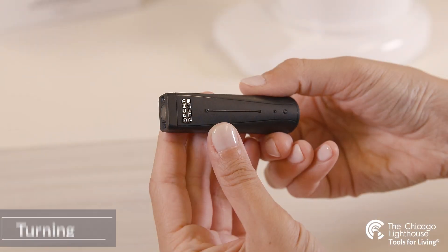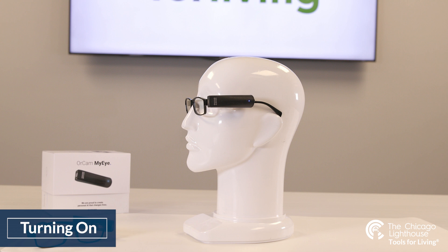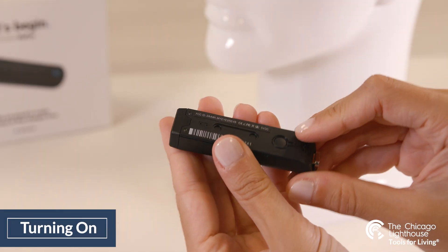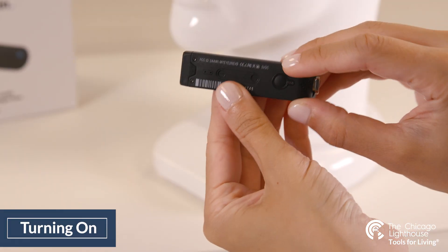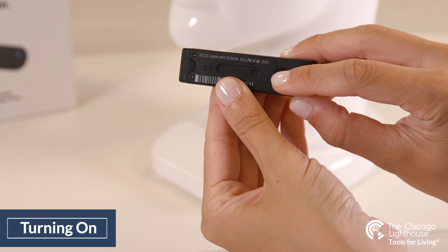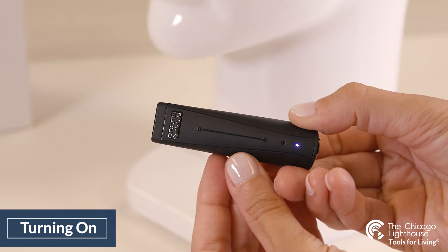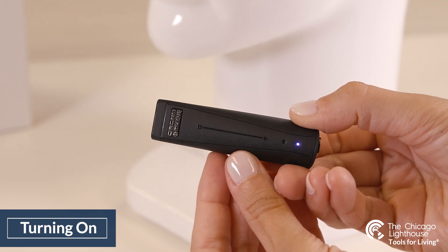Turning the device on and off is a breeze with a single button placed on the interior magnetic side of the device. To turn on, take the OrCam off of your glasses to access the button on the back side. Hold the button for 3 seconds and a small blue light will show up on the front side as the device turns on for about 90 seconds, emitting chirps until it begins to speak. The device will let you know when it's ready to use.